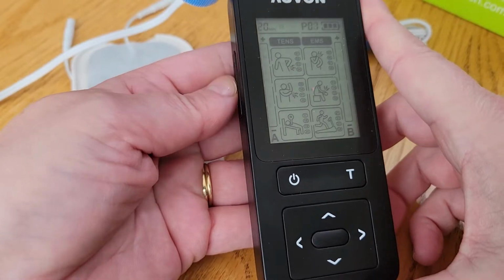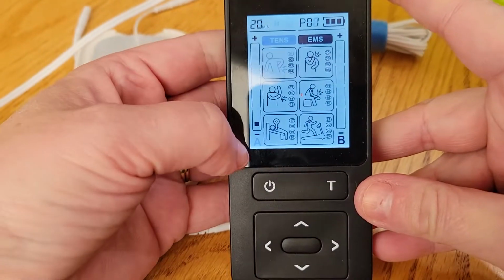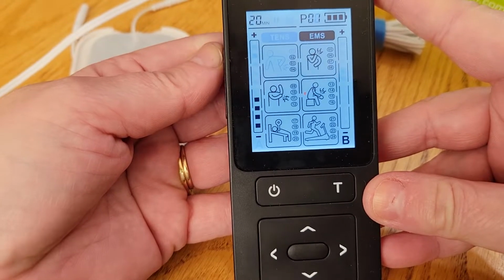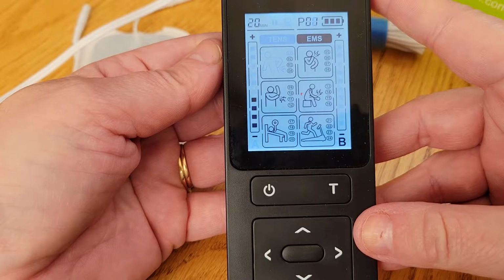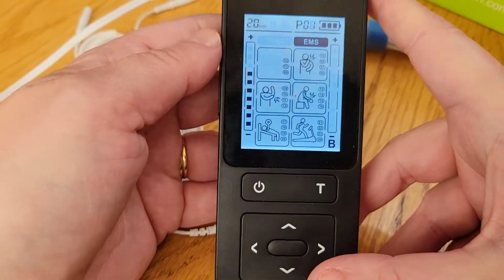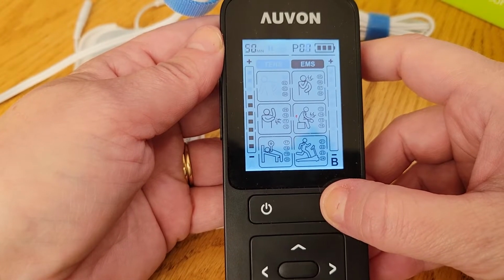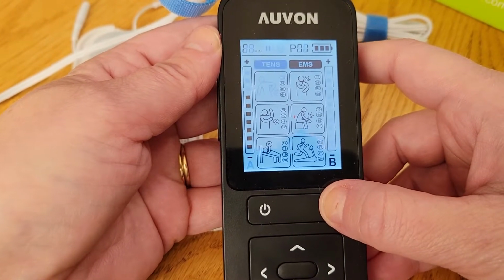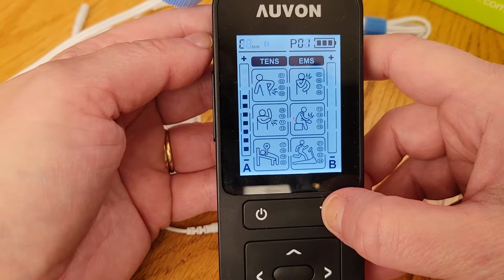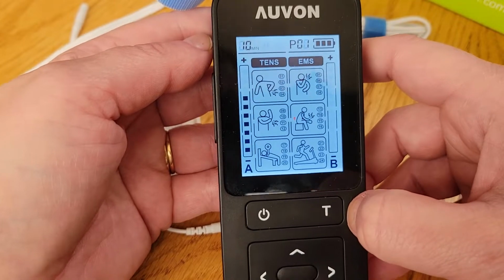So if you simply wanted to start from here, over on this side, you'll go ahead and press the plus button. And that's going to turn up the intensity, and you'll see that start right down here. And then you can go all the way up, or as much or as little as you want. Up here it says 20, and that's the timer. And this one has a continuous timer. So you can just add up, and when it gets over 90, it goes to C, if you see right up there. And that means it's on continuous timer. And it will not shut off until it either loses power or you shut it off. Again, I'll just change that right back by pressing the T button to a 2.